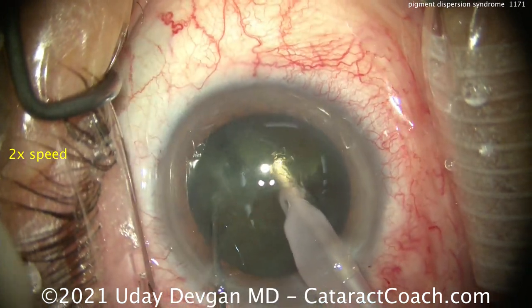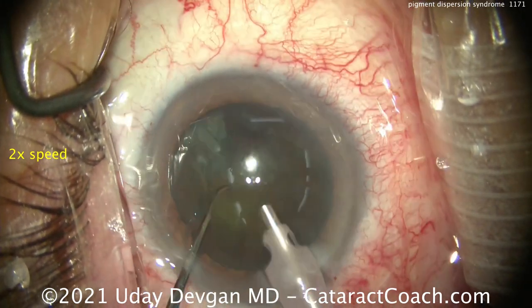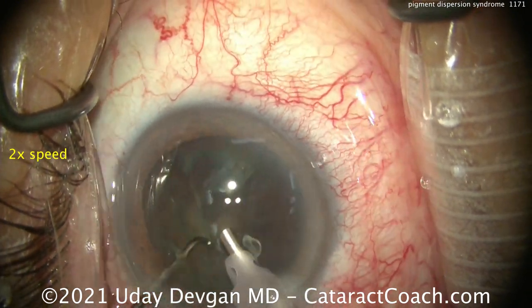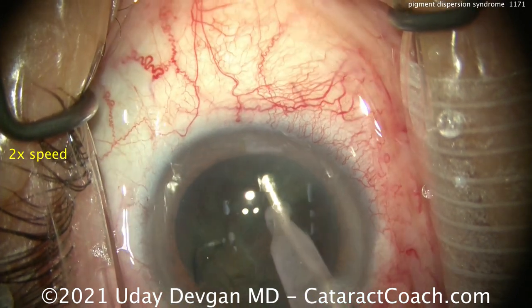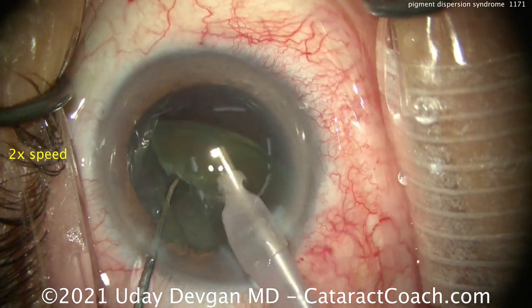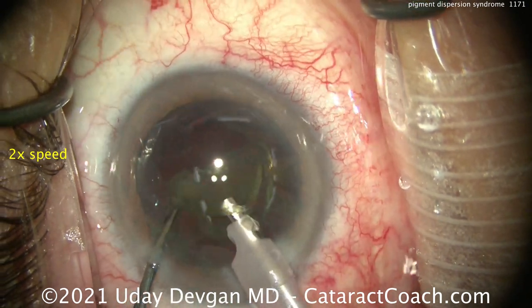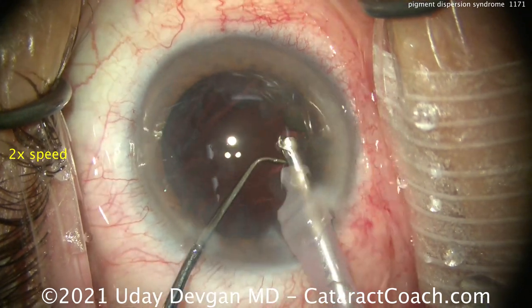But this patient still needs follow-up for glaucomatous changes. Now when we do phaco here, we're running all this fluid through the eye — washing out the anterior chamber many, many times, dozens of times at minimum and sometimes even a hundred or more. By doing this we're washing out a lot of the dispersed pigment, though we're not one hundred percent removing it.